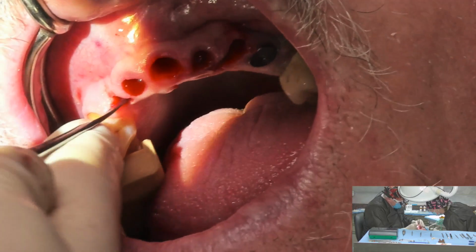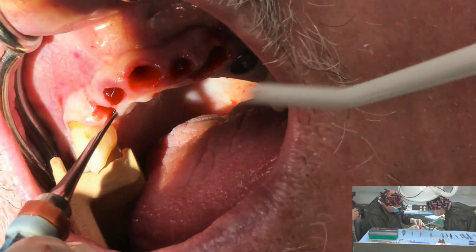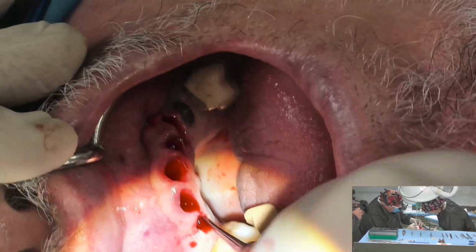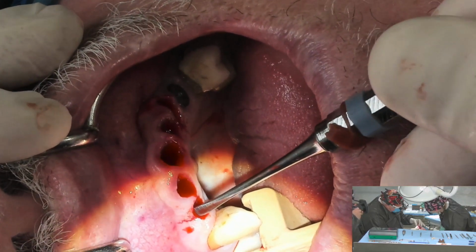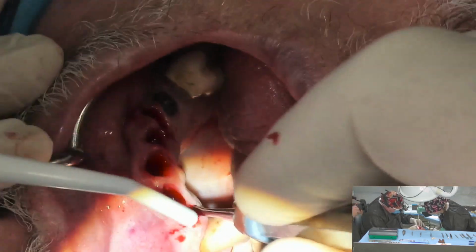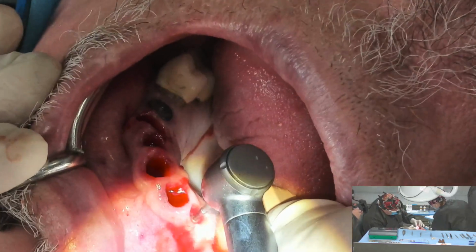So we've got just a little tissue here. I'm just trying to evaluate now the thickness of the ridge. Suction, Nina, careful on the facial because you see here I got a little tissue, okay? Yep, well, it's okay. Okay, so we're going to do more palate. So suction one more time back here, palate. Good. All right.